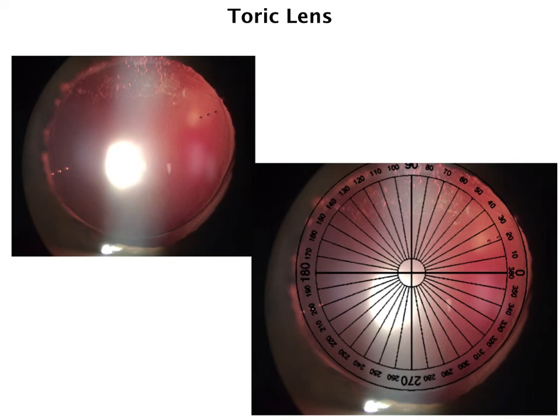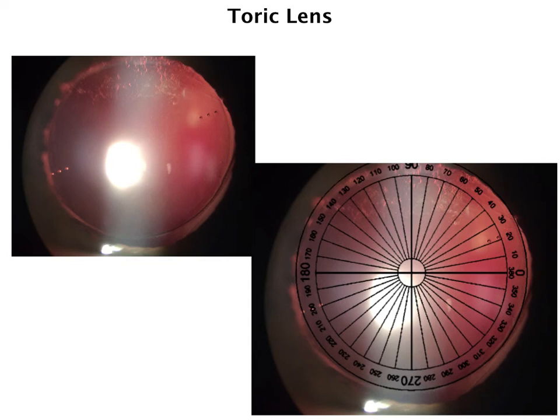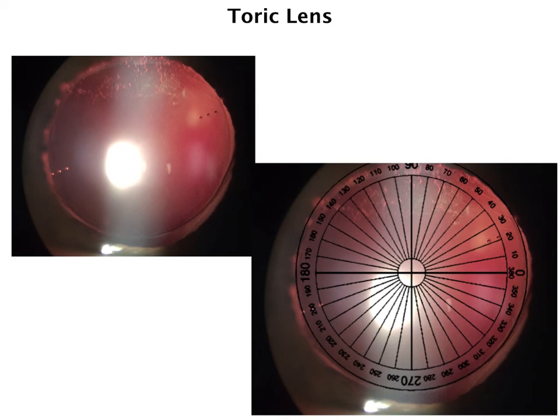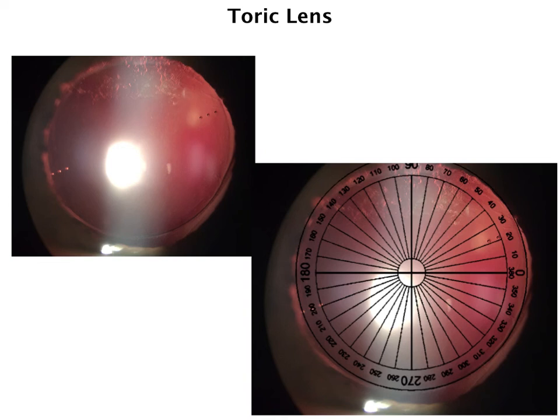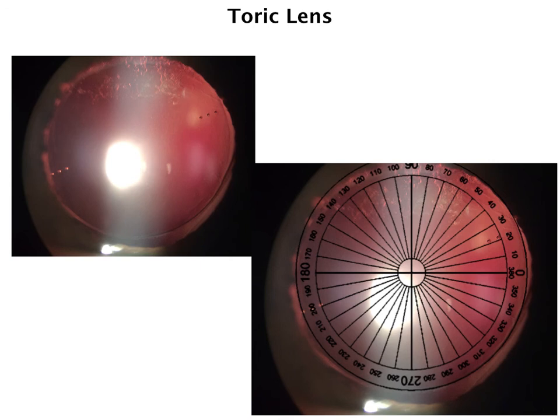A topic of large discussion is toric lenses — there are a lot of applications with photography. The first step is getting the picture, and the best way to do that is with the retroillumination technique, because it really helps to highlight those orientation marks. Now using Photoshop, we can overlay a compass rose over the center of the lens, and that way we can see the angle of the orientation markings, and we can compare it to our pre-op calculations to make sure that there's been no shifting of the lens. There are other applications — we can do back calculations — and there's a lot of research going on that idea, but that's going to be saved for another talk.